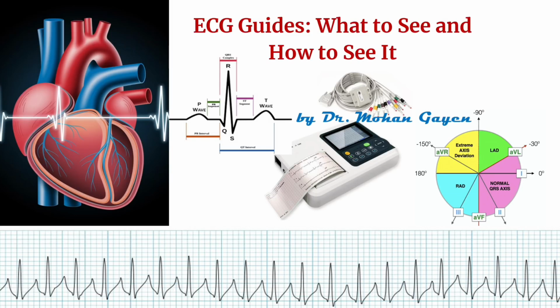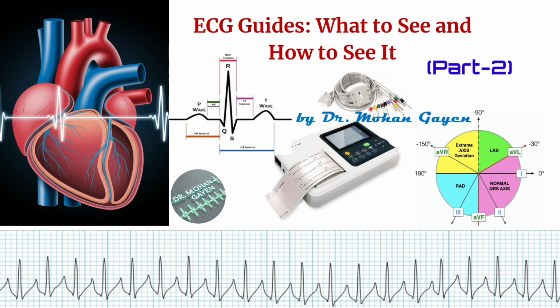Welcome back to the ECG Series Part 2, where we continue our journey into mastering electrocardiography. In our previous session, we explored the fundamental principles of ECG interpretation, including understanding the electrical conduction of the heart and systematically analyzing an ECG.